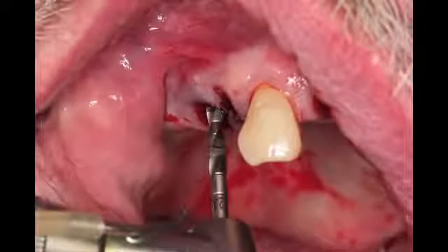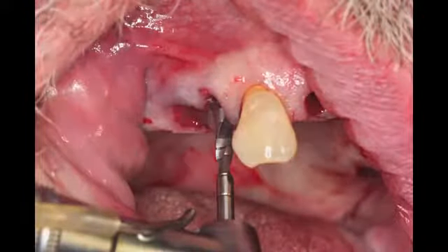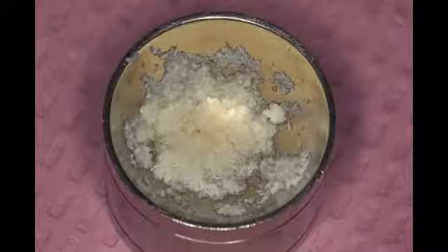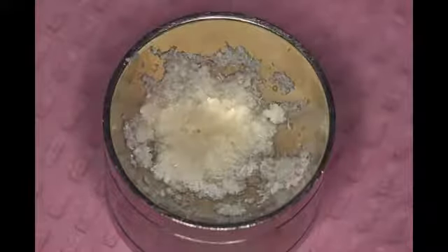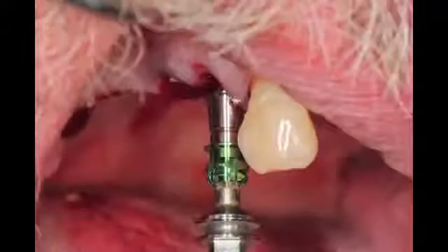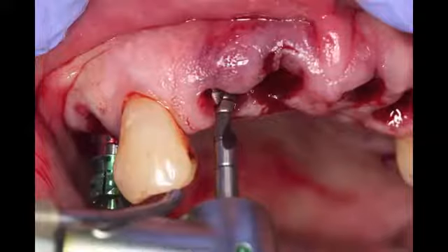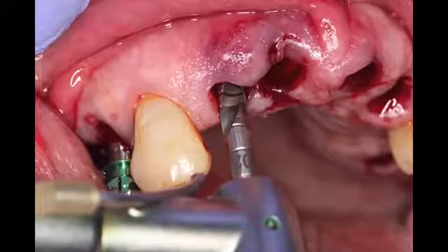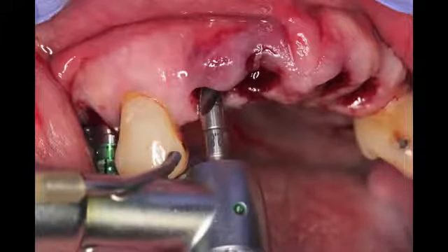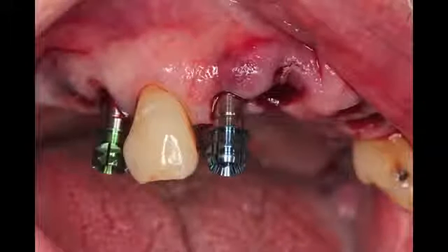Now I'm going to use the Implant Direct Legacy 3 system. We're going to create our osteotomies to place 4 maxillary dental implants. We're using direct gen allograft material from Implant Direct, wetting it with sterile water or saline, filling the socket, and using our Legacy 3 dental implant, ratcheting into place, torquing it here to 25 Newton centimeters, which is very, very adequate stability. We're in ideal position, placing our second implant in the socket site, creating our osteotomy openings using subsequent wider diameter burrs to the correct depth, placing our Legacy 3 dental implant and torquing it into position.